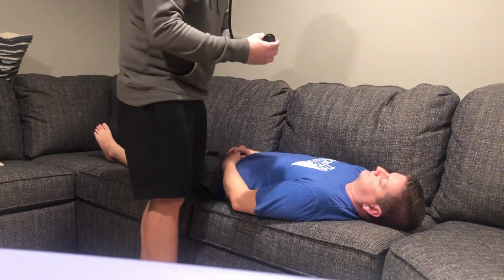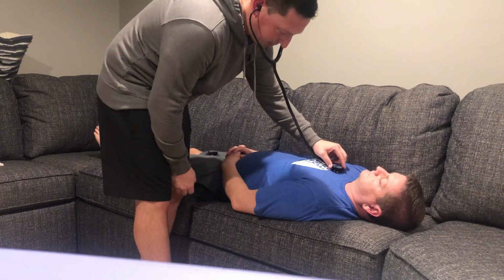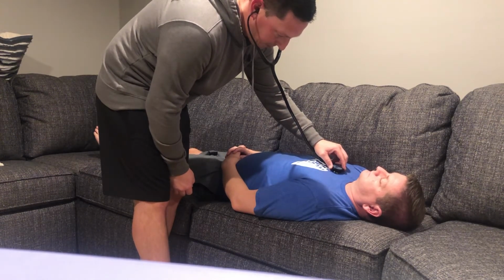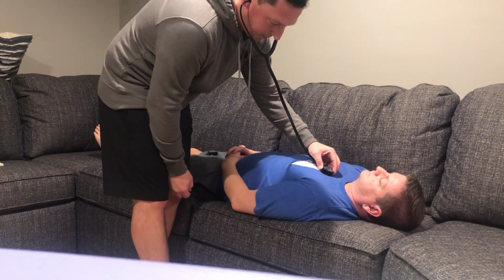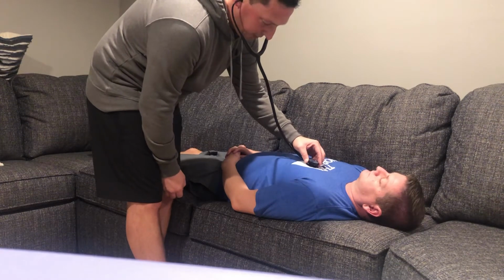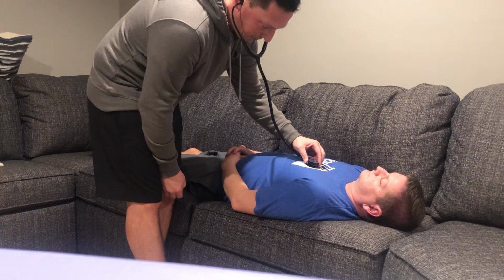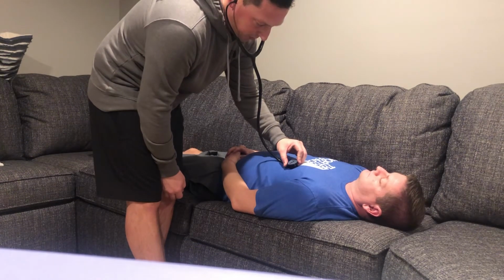I initially auscultated with the diaphragm. Now I'm going to flip it over and auscultate with the bell. Same positions. Second intercostal space, right sternal border. Second intercostal space, left sternal border for the pulmonic valve. Fourth intercostal space, left sternal border for the tricuspid valve. And fifth intercostal space, midclavicular line on the left side for the mitral valve.